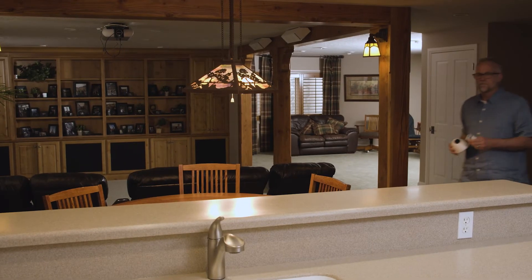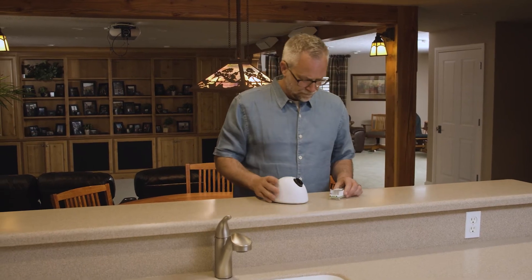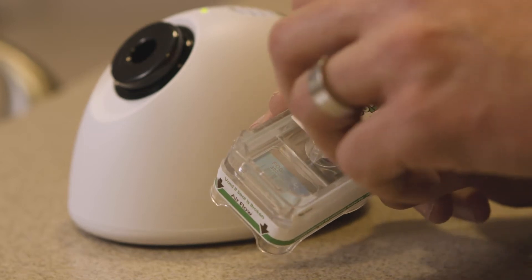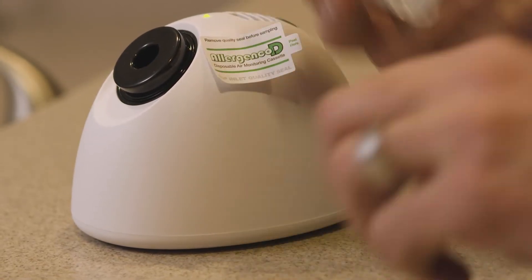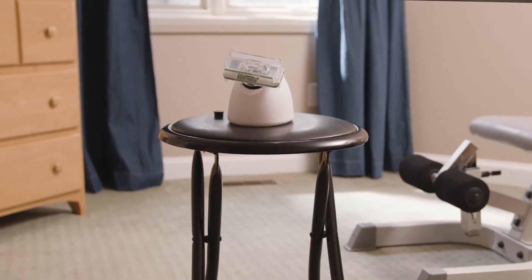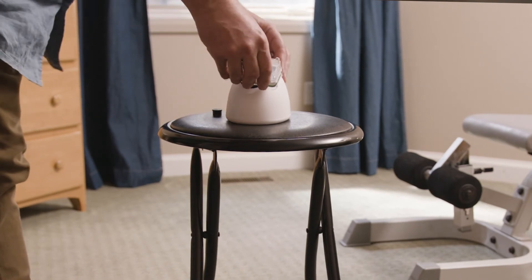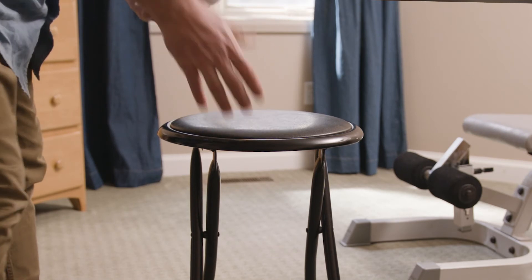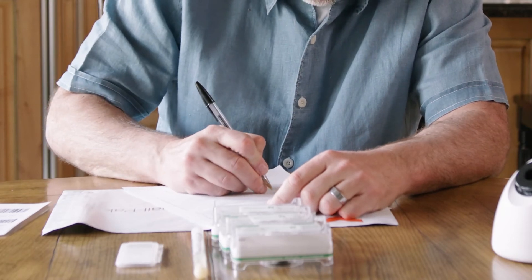Once you have found a good location for taking your samples, you're going to want to set up the pump in a spot that is in the center of the room and within the breathing zone, which is approximately three to six feet from the floor. You can set the pump on a folding ladder, countertop, or other piece of furniture to get the optimum height. Remove the covers on both sides of the sampling cassette — make sure to hang on to the covers since they will need to be replaced on the cassette after sampling. Press the on button to start the pump. The pump will run for five minutes and auto shut off. Once the pump has finished running, return the covers to both sides of the cassette. At this point you're going to want to label the cassette and fill out the information on the chain of custody form.